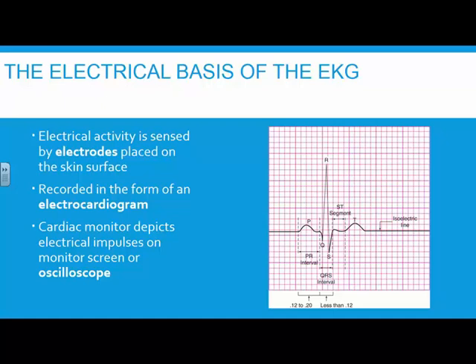Then you get into the turn of the century, the start of modern EKG monitoring. This is where this German dude named Dr. Willem Einthoven comes in. We're going to talk a good bit about old Einthoven, because he had this triangle that we're going to learn about.